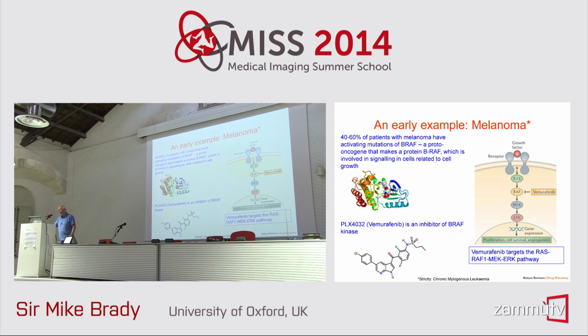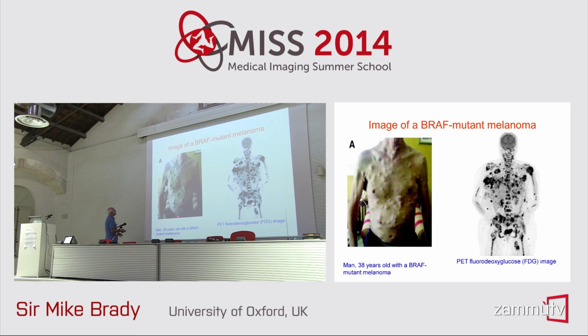Does it work? Well, here's a patient, this is a 38-year-old man, and you can see there are many, many skin cancers all over this guy. You don't need an image to tell you that, a photograph will do it. However, if you take a PET image of that guy, you can see just how extensive the cancer is in this guy. That's a particularly horrible photograph, right? Well, what about this drug, vemurafenib? 3 weeks. There to there.